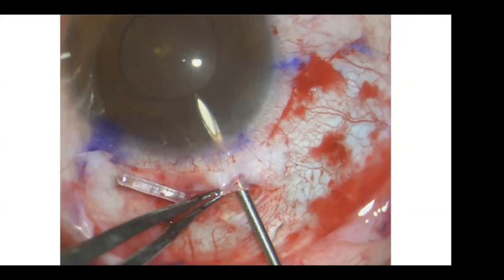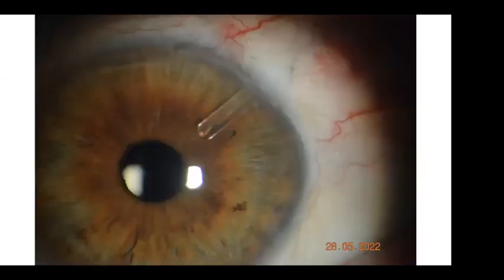We can have this needle connected to Healon, so that once you inject Healon, it will fill the anterior chamber and will lubricate the entry site. Alternatively, you can make a paracentesis and inject Healon. At the time of the implantation, I don't want to lose the anterior chamber. Either I inject Healon in this area in particular to make it deep at the time of insertion of the tube, or I just take the needle on a Healon. And that could be enough length. It is 2.5 to 3 millimeter.